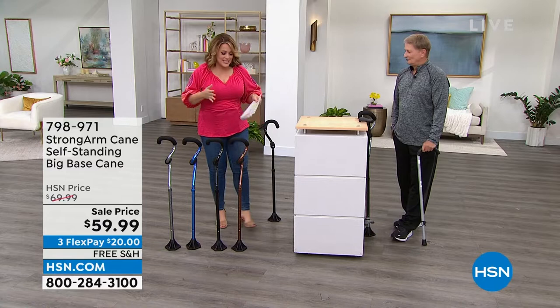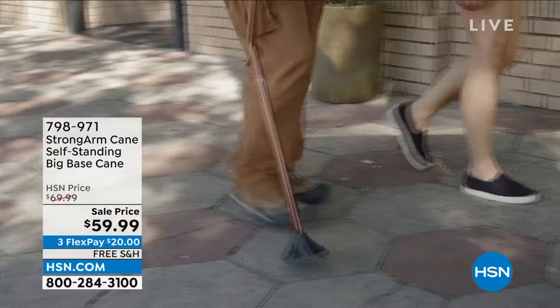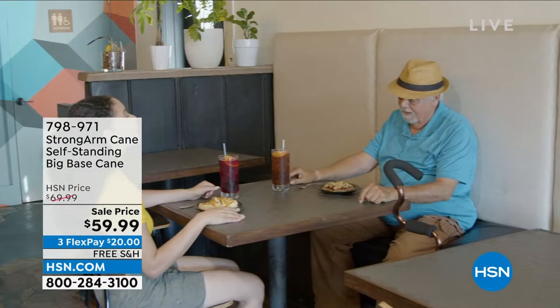This is really cool because essentially most canes force you to put the pressure and all of the weight on your wrist. This one shifts that weight to your forearm. So more independence, more short steps. The biggest base that we've ever done, so first time ever with that extra wide base.